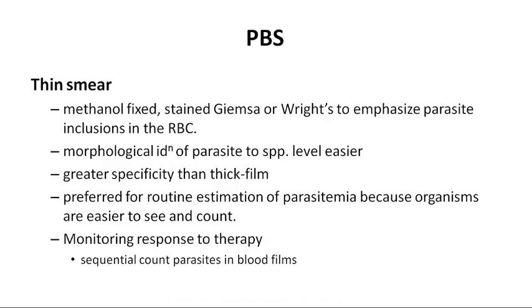Whereas the thin smear is prepared by spreading a blood drop on a slide, which gives a uniform layer of RBC, which is methanol fixed and stained with Giemsa or Wright, and which helps to visualize the parasite in the RBC. Morphological identification of the parasite even to species level is easily done using a thin smear peripheral blood examination.